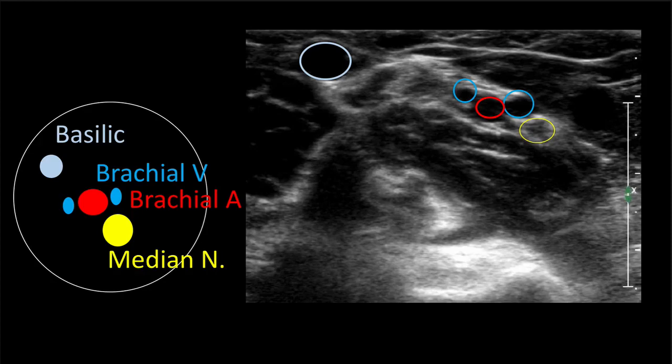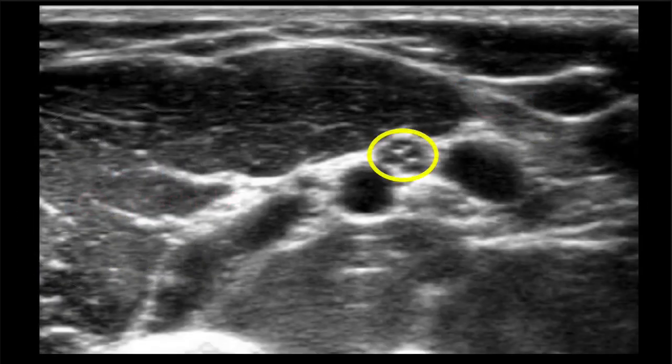So you don't see the nerve here well, so here's another shot. That's the nerve, like the little bundles. That's a normal appearance of the nerve. And this would be a good one also that'd be really tricky to say, okay, which one? This is actually the artery. It'd be hard. Artery, vein, which vein? Well, I'll tell you, this little tiny piece right here is actually brachial vein. And this is actually basilic. If they make you pick, the bigger one is the basilic, okay?